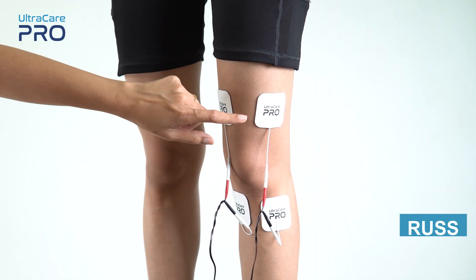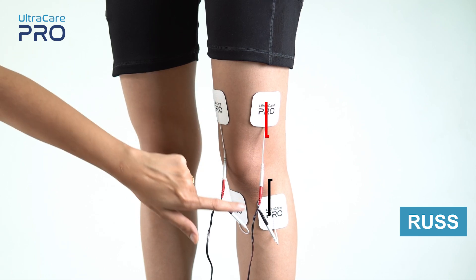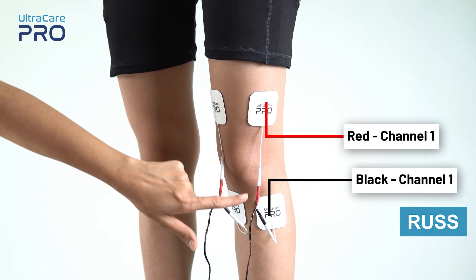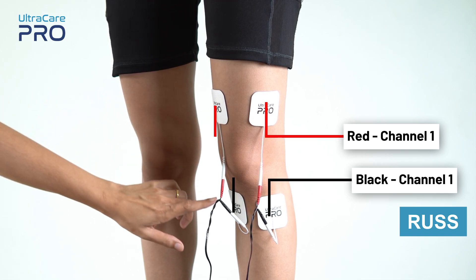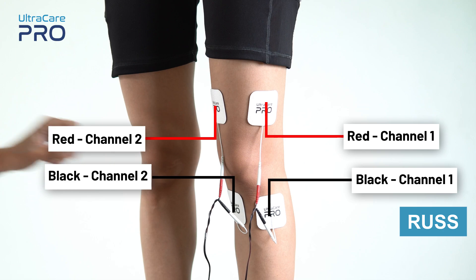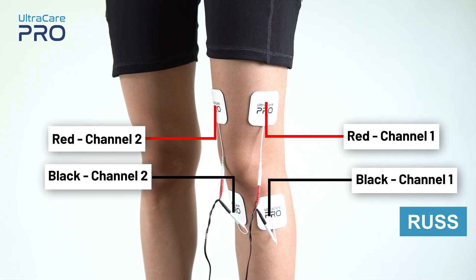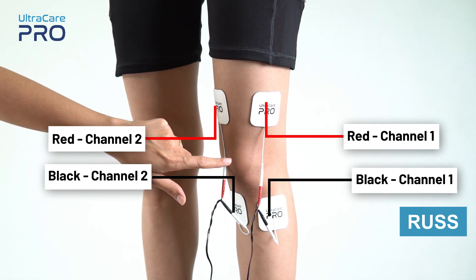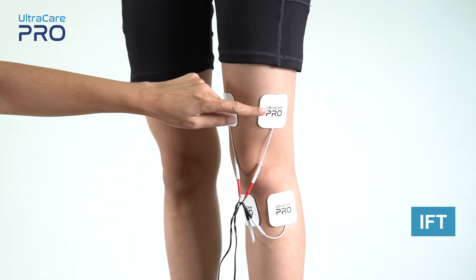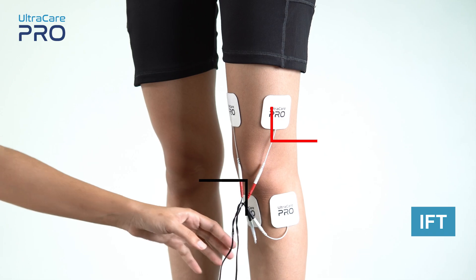For Russian currents, place the red and black electrode from channel 1 on the outer side of the knee joint, over the muscle that needs to be stimulated. Similarly, place the red and black electrode from channel 2 on the inner side of the knee joint where the muscle needs to be stimulated, ensuring the center of the knee joint is not covered and the muscles are well stimulated.